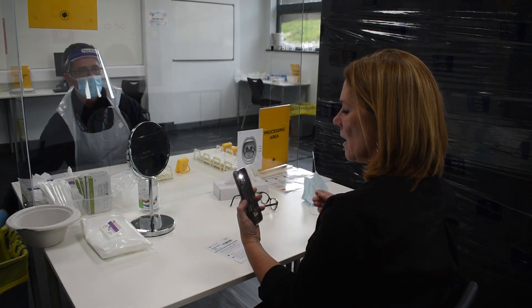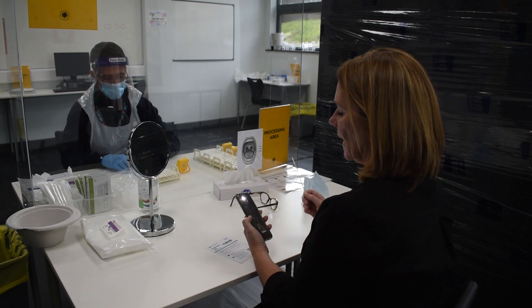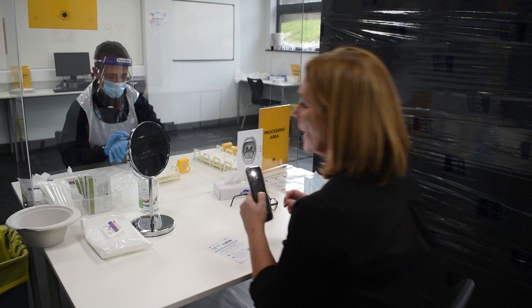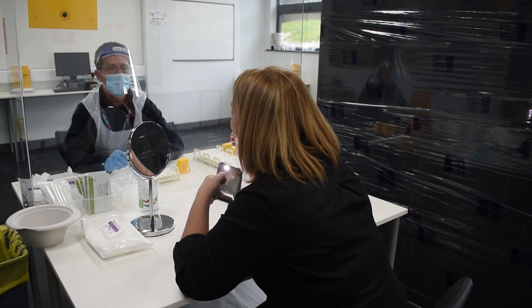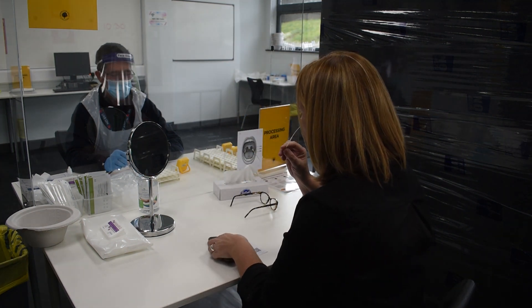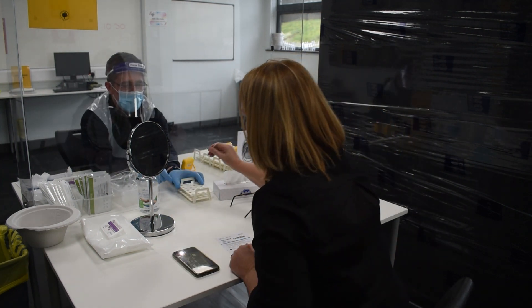I'm going to use my phone and this mirror here just to help me. In past tests it's helped me to use the torch on my phone so that I can see clearly where my tonsils are. And that's it — just place it in the vial for me please.